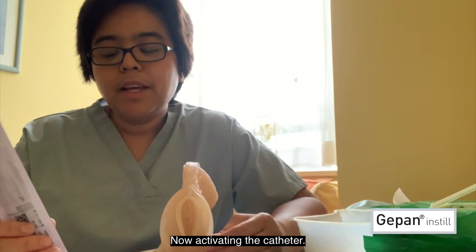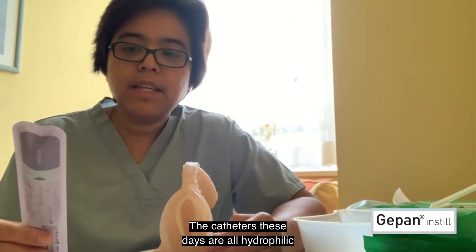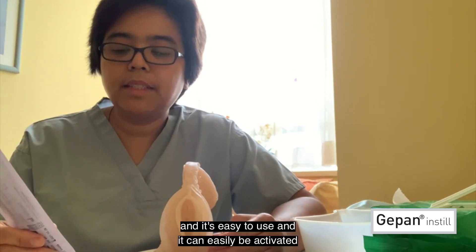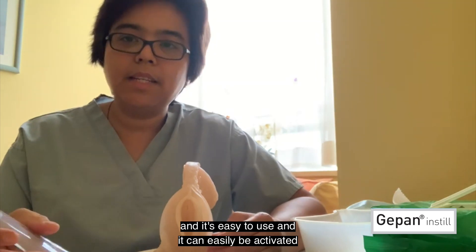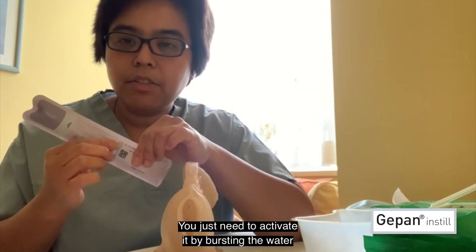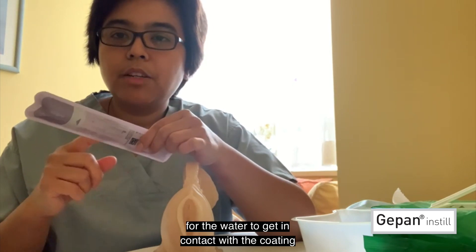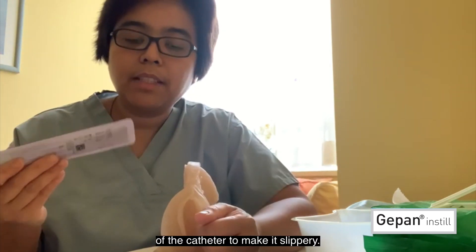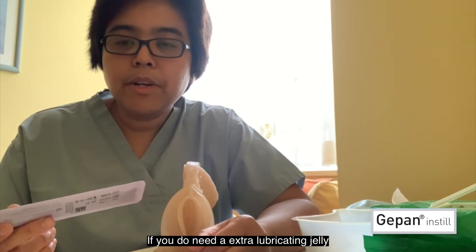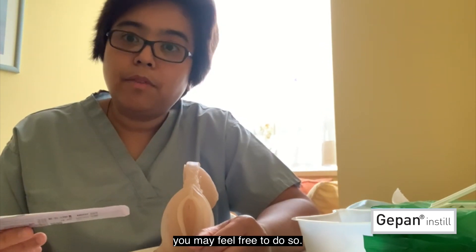Now, activating the catheter. The catheters these days are all hydrophilic and easy to use. They can be activated with the water that is included in the packet — you just need to activate it by bursting the water for it to get in contact with the coating of the catheter to make it slippery. If you need extra lubricating jelly for additional lubrication, you may feel free to do so.